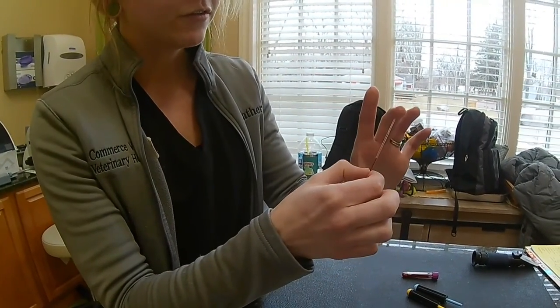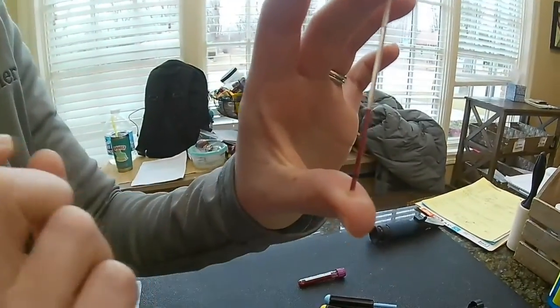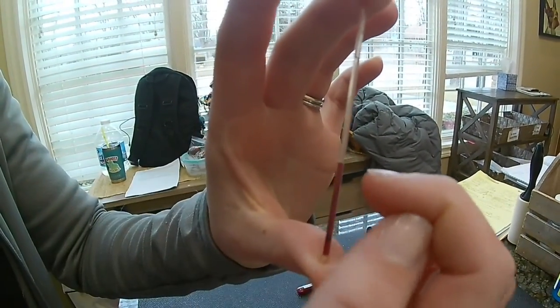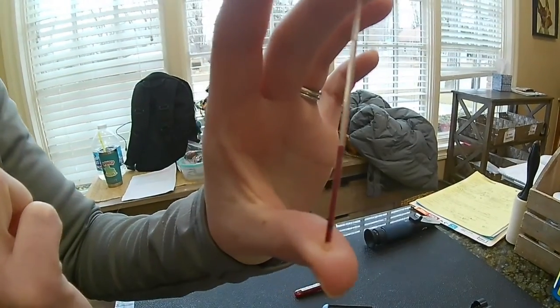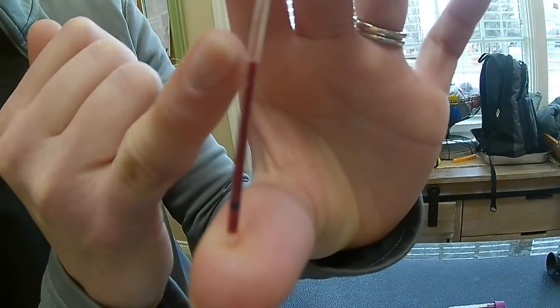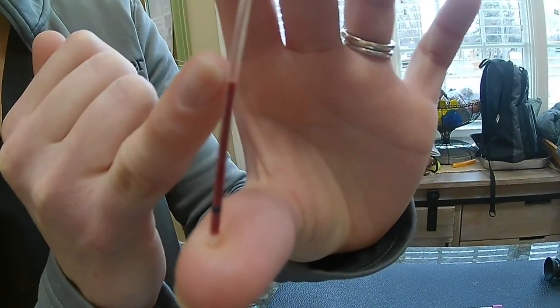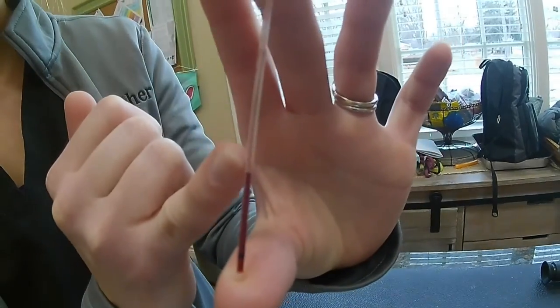The different layers in here, so we have all of our red blood cells right here, this packed. And it's kind of hard to see, but there's almost like a little grayish opaque disc right at the top of those blood cells. Okay, and that is our buffy coat. And that's kind of where our white blood cells are sitting. And then up here is all our plasma.